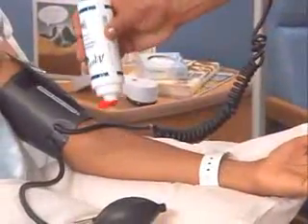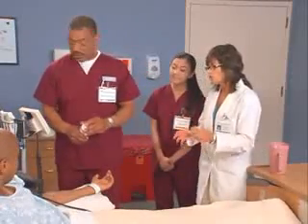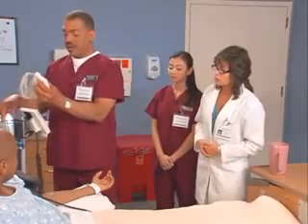And this might be a little cold. That's okay. Just more bonus points for me. And try using the Doppler first. Use it in your non-dominant hand. Okay, that'd be my right.